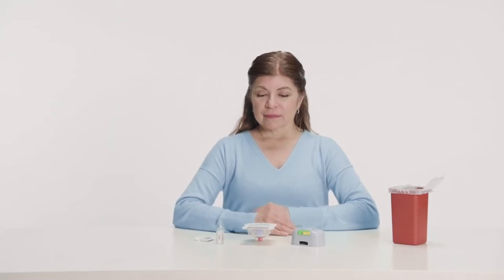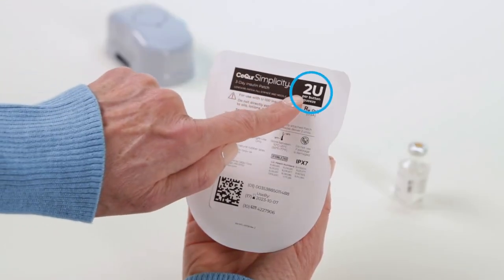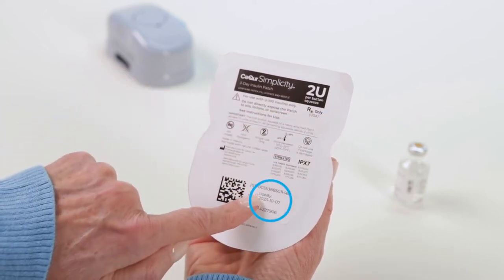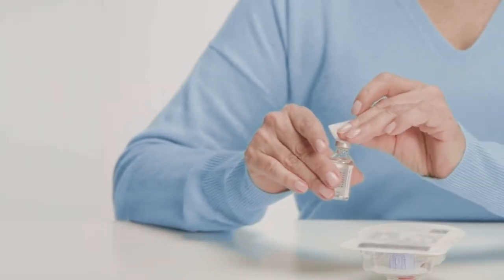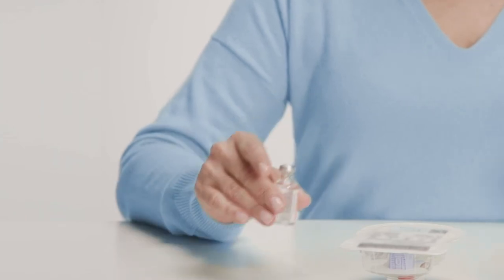First, check the patch packaging to make sure it is sealed and not damaged. Then make sure the 2U per button squeeze on the patch label matches what was prescribed by your healthcare professional, and that the use-by date has not expired. Wash your hands with soap and water, then clean the rubber top of the insulin vial with an alcohol wipe.